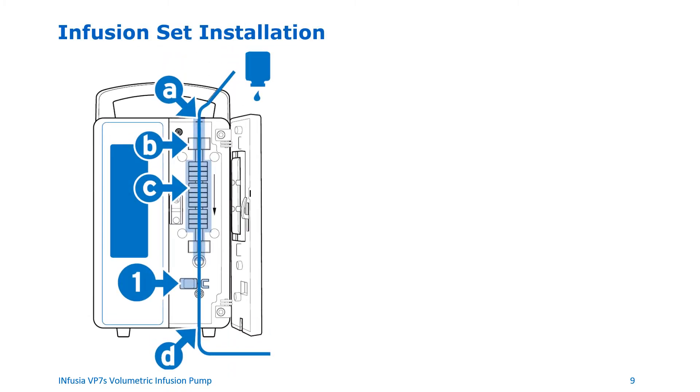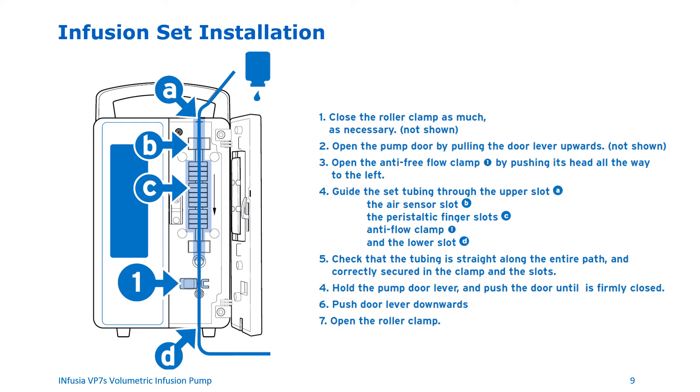Installation of the infusion set. First, close the roller clamp. Then open the door by pulling the door lever upwards. Open the anti-free flow clamp by pushing its head all the way to the left. Guide the set tubing from top to bottom through the upper slot (A), through the air sensor slot (B), through the peristaltic finger slots (C), and finally through the lower slot (D). Check that the tubing set is straight along the entire path and correctly secured in the clamp and the slots. Hold the pump door lever and push the door until it is firmly closed, then push the door lever downwards. Finally, open the roller clamp. Your infusion set installation is now complete.